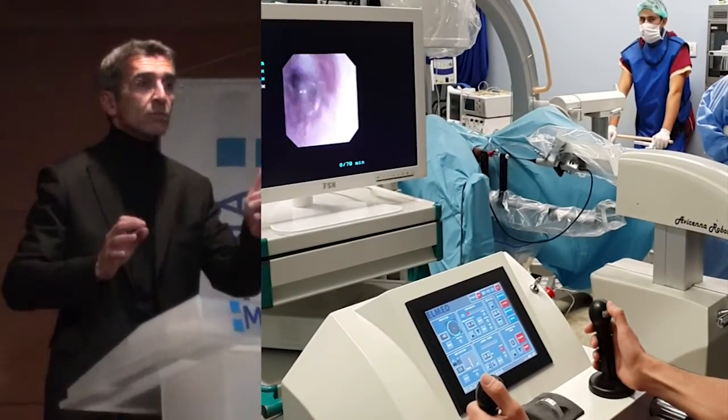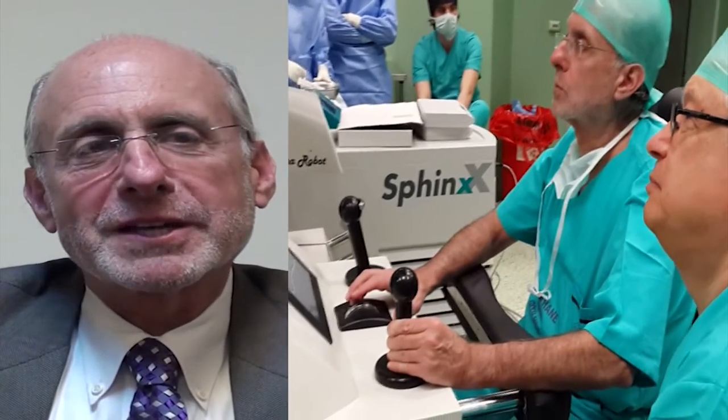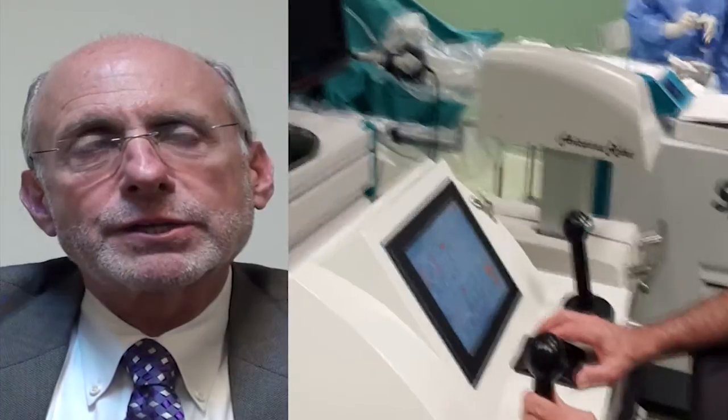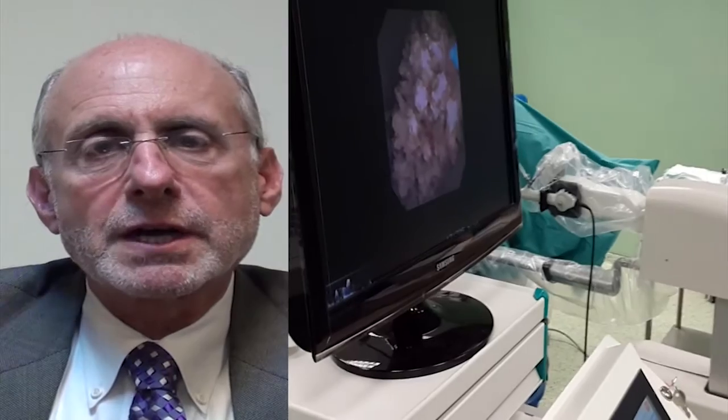To place the scope into the robot takes maybe less than two minutes. One expert noted being very impressed with the robot — it took a little bit of getting used to, but after three or four cases you would feel very comfortable.